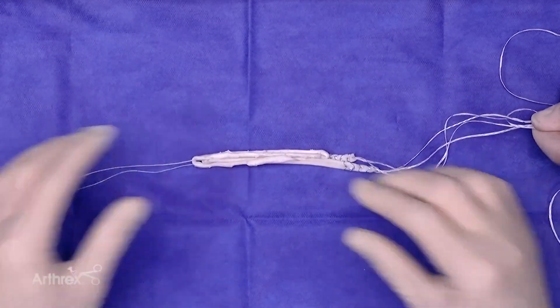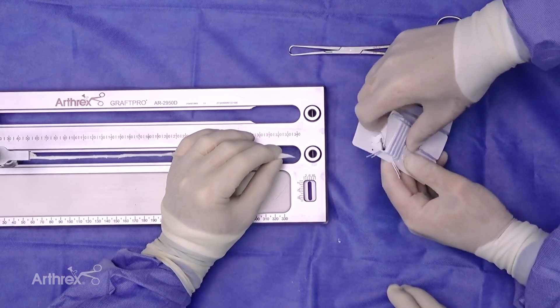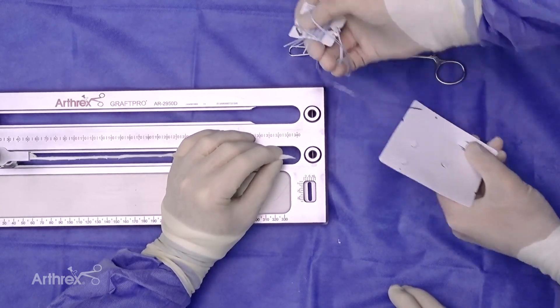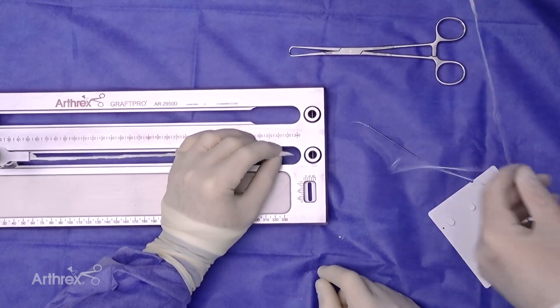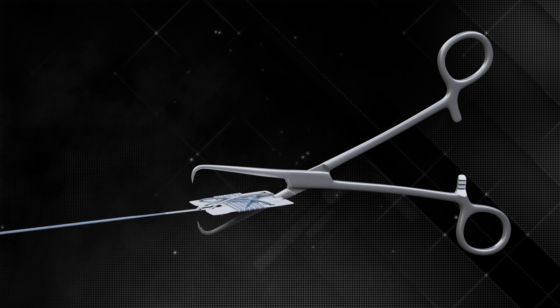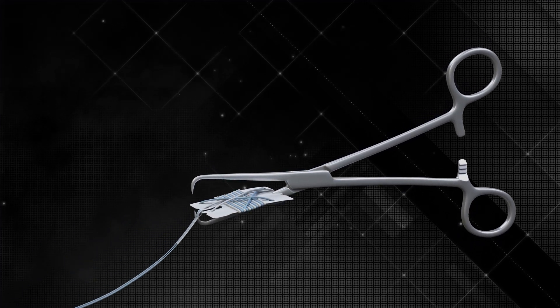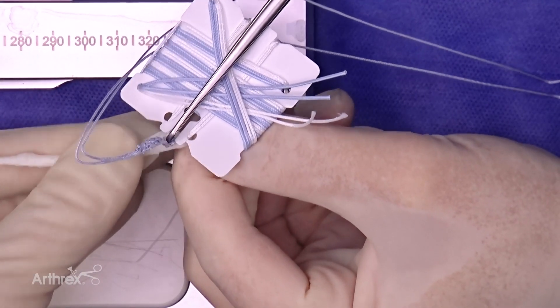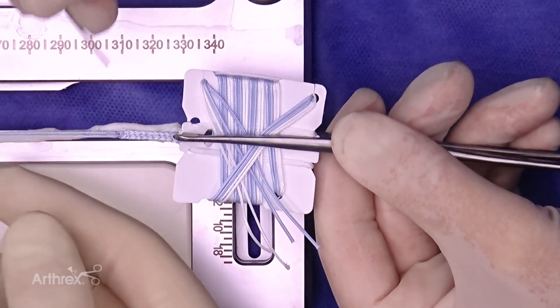We will now demonstrate the fiber tag technique. We will demonstrate loading the fiber tag on the end of the semitendinosus autograft to allow a tripling of the graft. Once the fiber tag is removed from its specific implantation card, the sutured clamp can then be loaded onto the fiber tag to allow ease of preparation. The clamp has a special slot that is loaded underneath the tightrope and allows an easy puncturing of the fiber tag, which then sits into a specific groove in the tag. The graft clamp is punctured through the fiber tag, and then the graft at the end is similarly grabbed with the specific clamp.